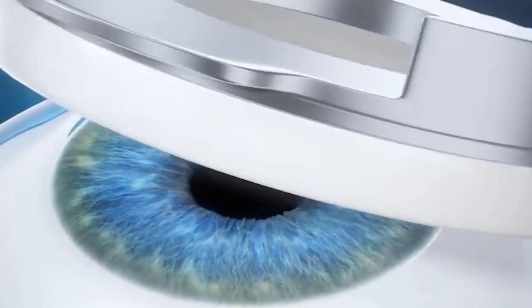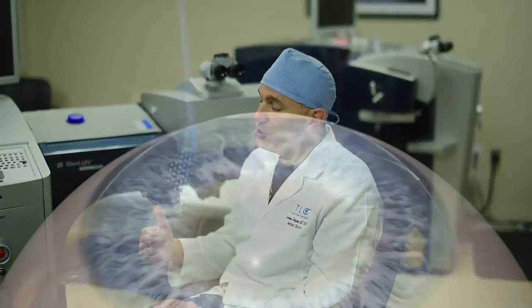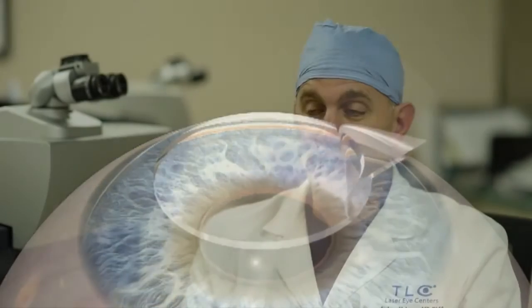In the past, we used to make that flap — that 100-micron flap — with a device called the microkeratome, which had an oscillating blade. But approximately 14 years ago, a special laser was introduced that creates the flap completely, eliminating the need for the oscillating blade, and that made the procedure safer and more predictable. That's what's called all laser LASIK.